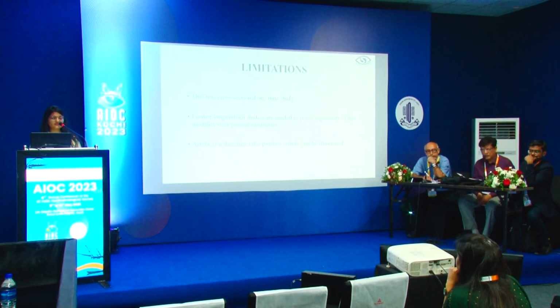Limitation: this was a cross-sectional one-time study. Further longitudinal studies are needed to prove superiority of the modality over present modalities. Artifacts and therefore false positive counts can't be eliminated.